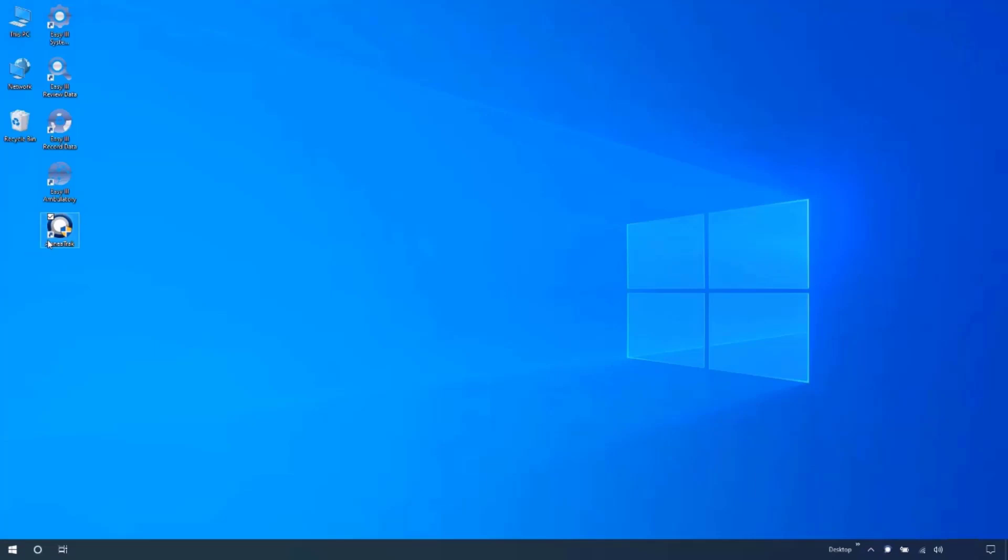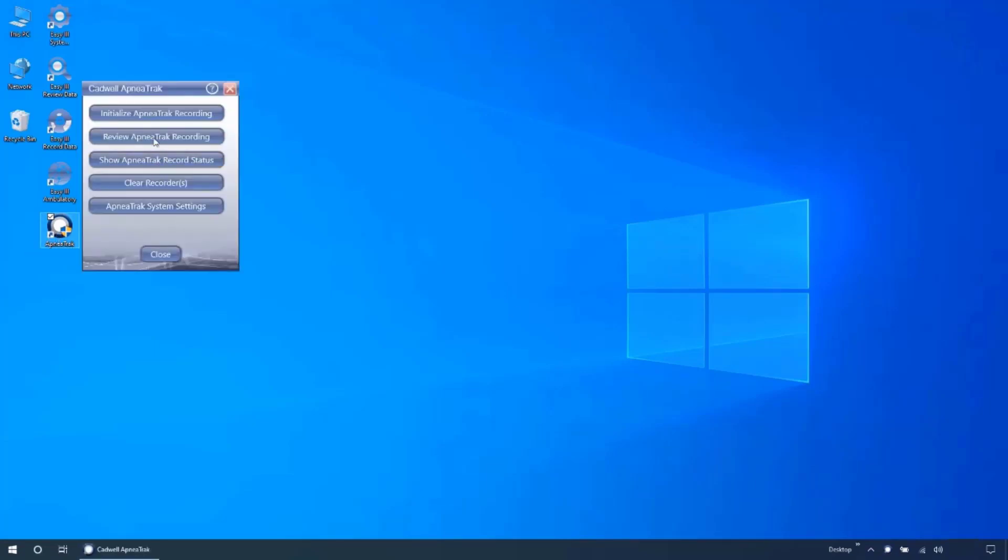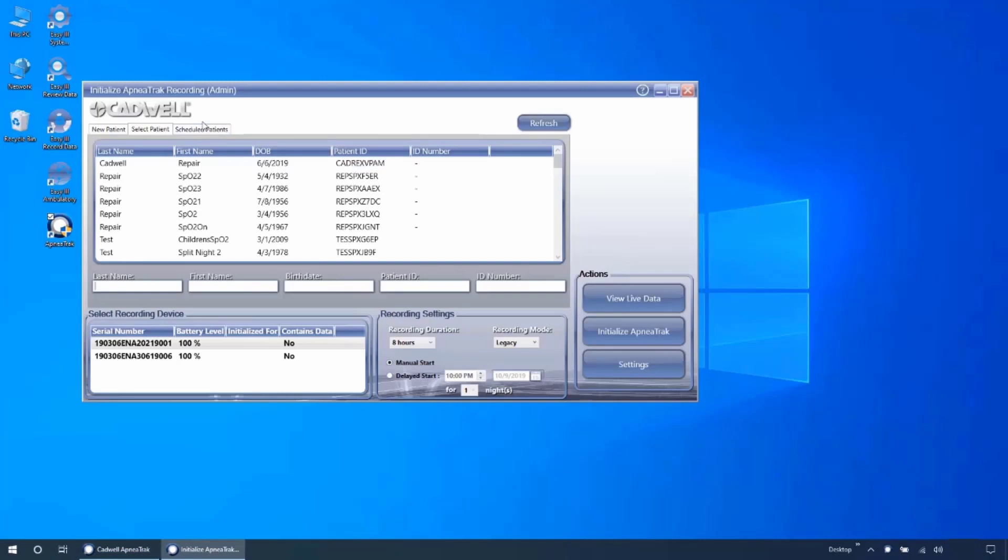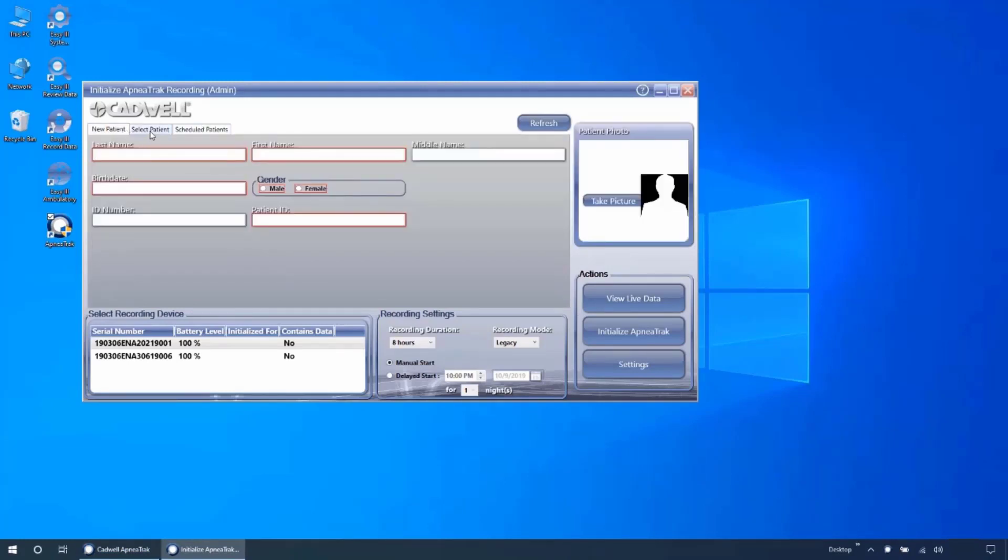Open the initialize ApneaTrak recording window. Across the top are three tabs: new patient, select patient, and scheduled patient. The new patient tab will allow you to manually input the appropriate patient information for initializing your device.